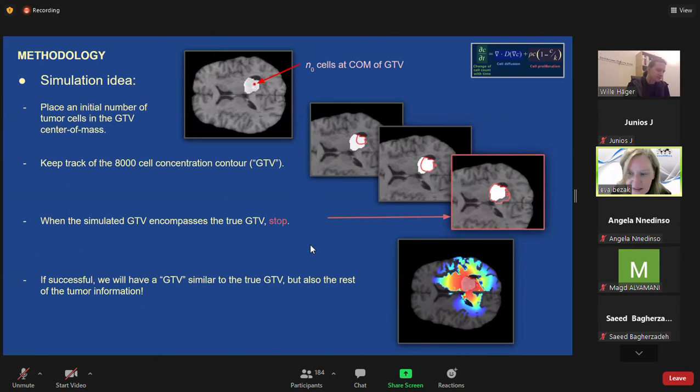Could you comment on the impact of different imaging devices for target visualization? For example, which MR sequences are critical? Could radiomics potentially help with validation? So yeah, this becomes a matter of how to segment the tumor automatically.